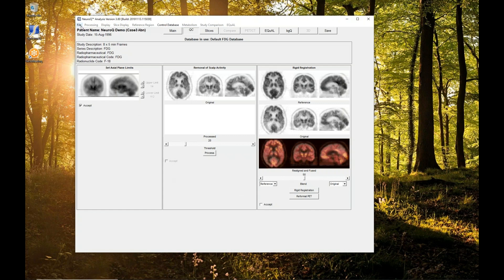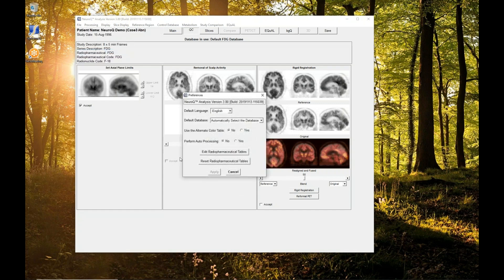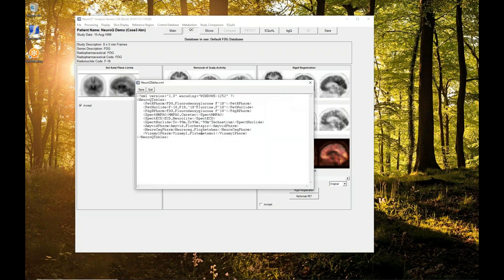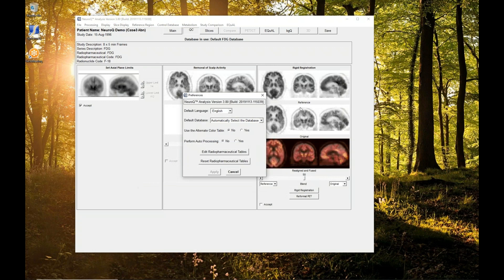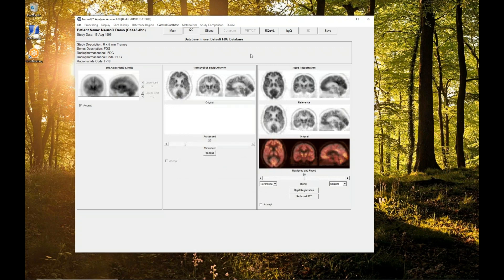There are quite a few preferences and radiopharmaceuticals. We have a table right now. It's not the most friendly, but it was the best we could do at the time so that you can add keywords to automatically recognize Vizamyl versus Neuroseq versus Amivid versus FDG or HMPAO or ECD. You can see that this one automatically determined that it was FDG.